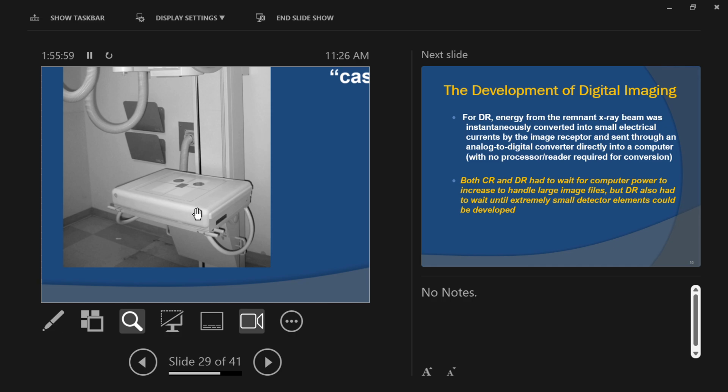So there's no such thing as tabletop images. You're not taking a cassette and putting it on the tabletop. It's built into the table or built into the wall, yeah. So like, in the X-ray room, you could just get a table like this and just do X-rays, right? If you were doing tabletop, you just can't do anything with the grid. Some tables like this one can tilt, right? But in principle, all you need is the X-ray tube, and then your DR cassette and computer.